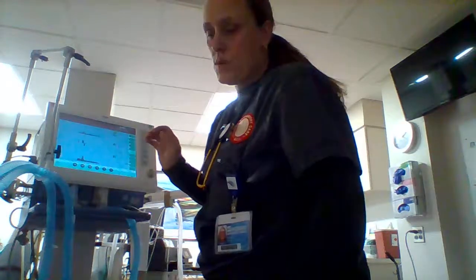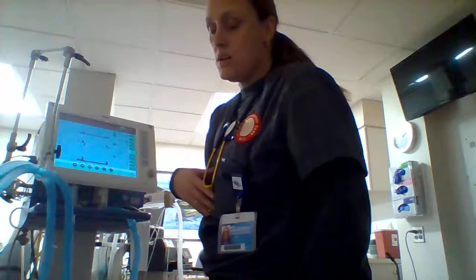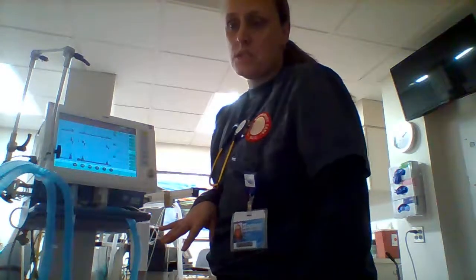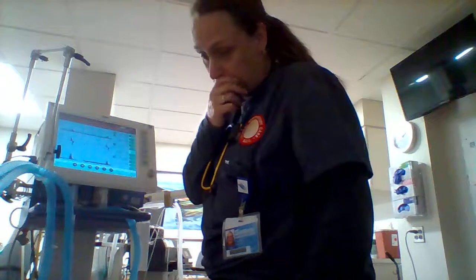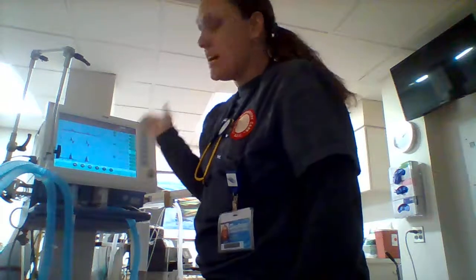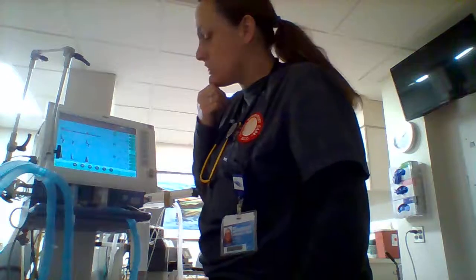She's been intubated, so we're going to verify placement of the tube. We'll listen right above the trachea, listen to both lungs, get a chest x-ray, and get an ABG right when she first comes in so we can see where we're starting. With the 300 milliliter tidal volume I can get a flow of about 22. The Draeger does have auto-flow, so that's on.